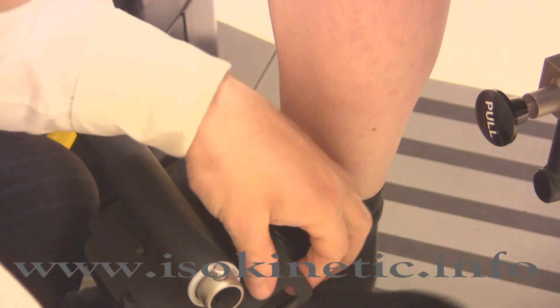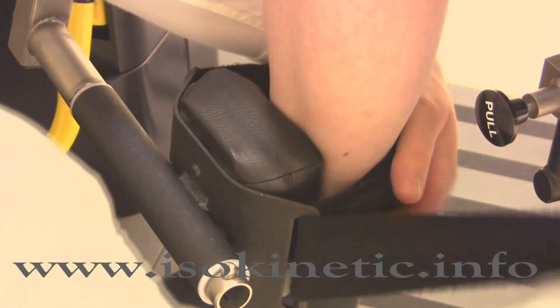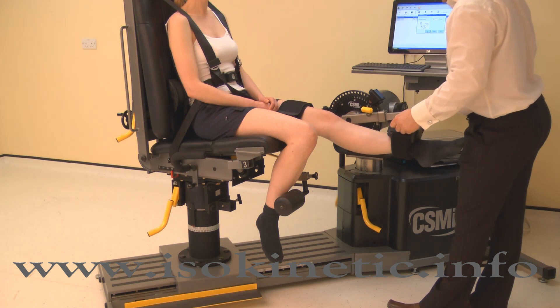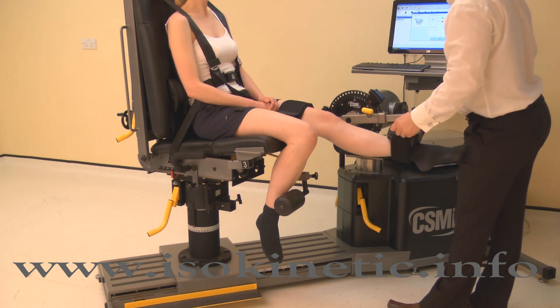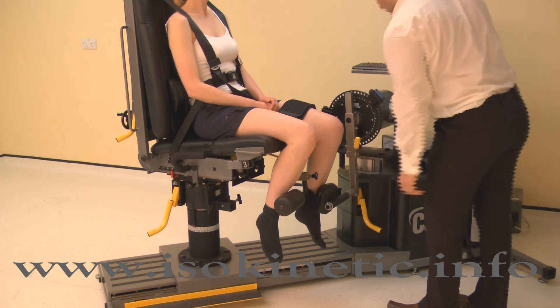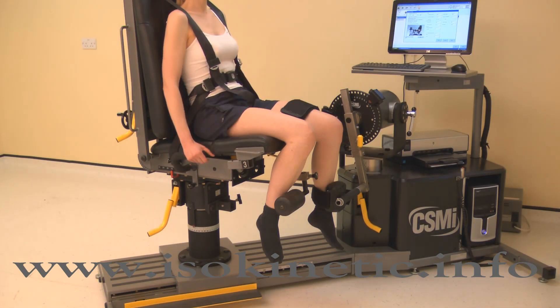To check the axis of rotation and the position of the pads, hold the calf pad next to the shin, then extend and flex the knee manually. If the pad rubs up and down the shin, the axis of rotation is wrong. Release the calf pad and reset the axis of rotation. During the movement, the subject should be encouraged to hold the fitted handles, as this has been shown to optimize results.